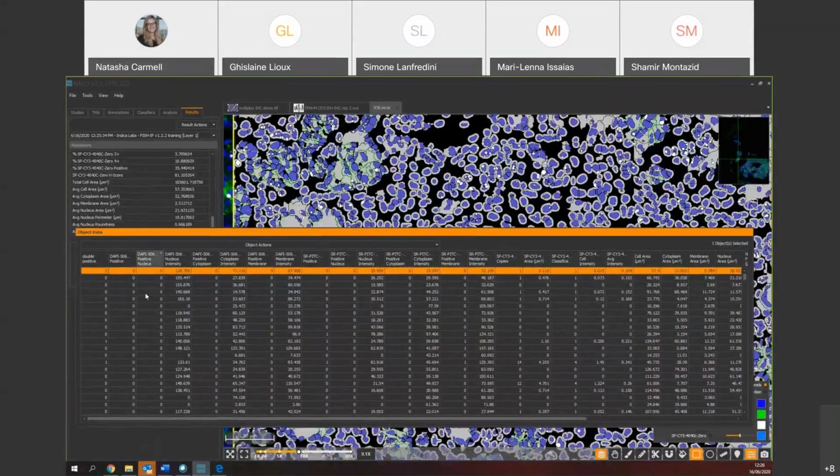And it's basically the same. You have your phenotype here, and actually that's probably why sometimes people set phenotypes, because if you wanted to, you could also not set a phenotype and just filter your data according to these filters here. But having a phenotype is a nice way of having the cells of interest in a straightforward way, and have a name assigned as well.